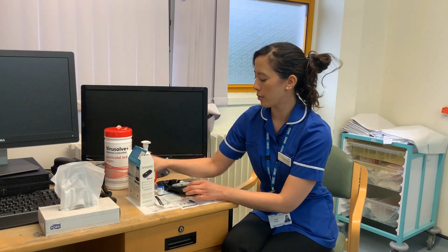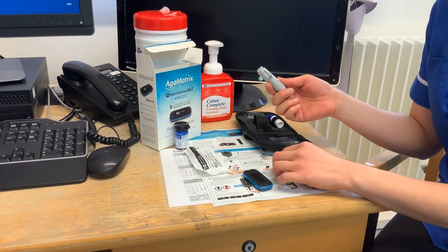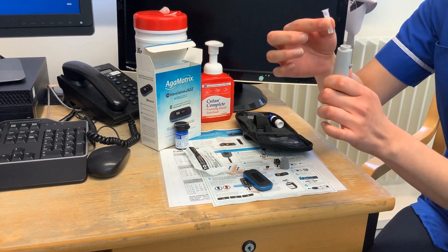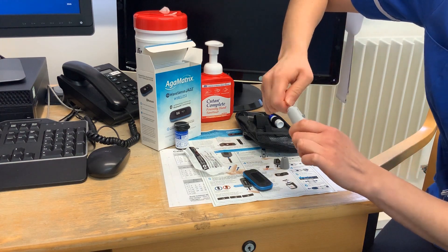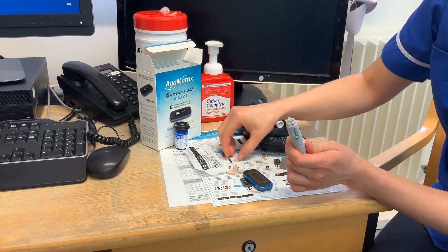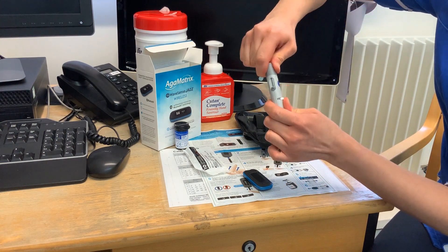First you need your needle. You would unscrew the cap off. The needle goes in this way around — you've got the cap at the top. Push your needle inside as firmly as you can and then carefully twist and pull the cap off. Save your cap for later, then pop your cap back on and push and twist at the same time to secure it.